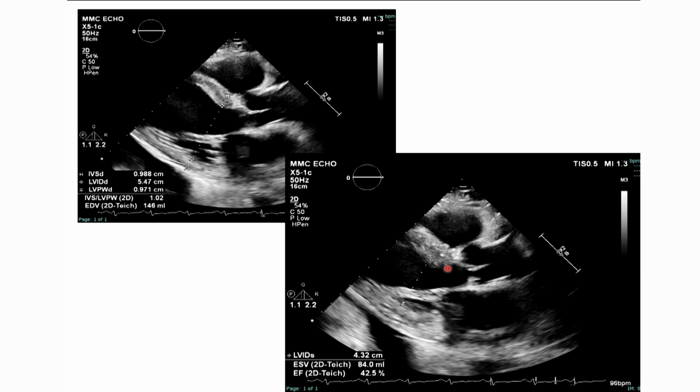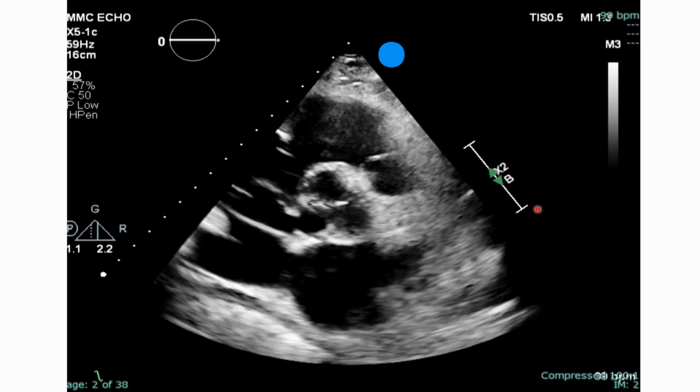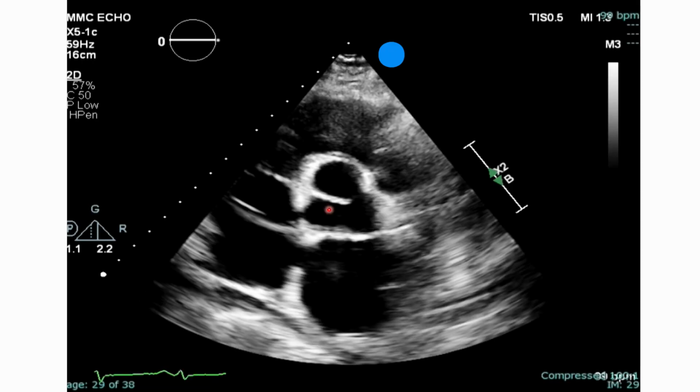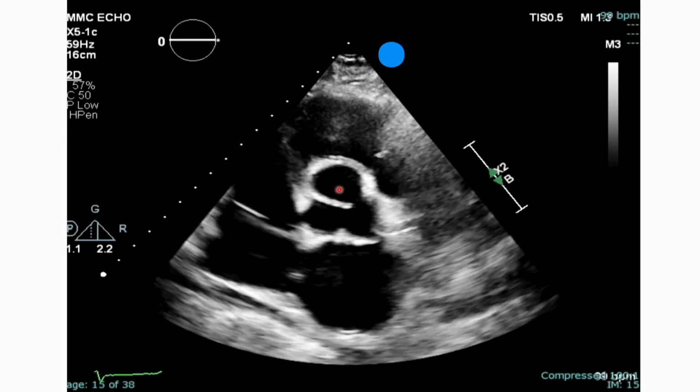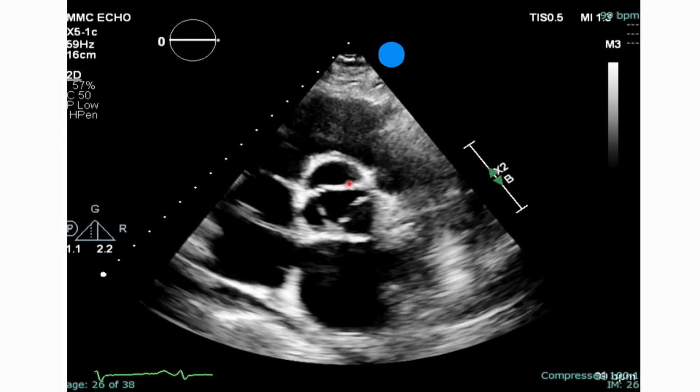What did we measure? 5.5 centimeters, no LVH. Maybe the EF, we have to obviously look at other views for our EF. Ascending aorta, a little dilated, 4.2 centimeters. Look at that aortic valve. It looks trileaflet. I don't know if I see anything dancing around there. I didn't say they came in with a fever if we're worried about endocarditis.